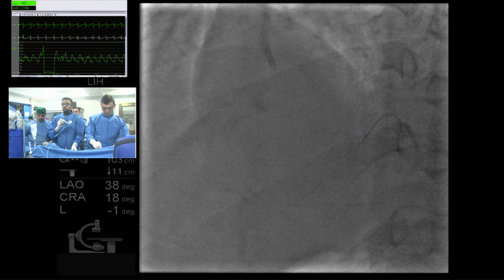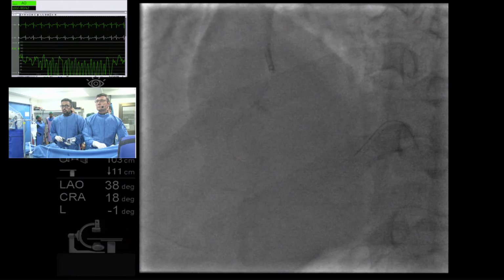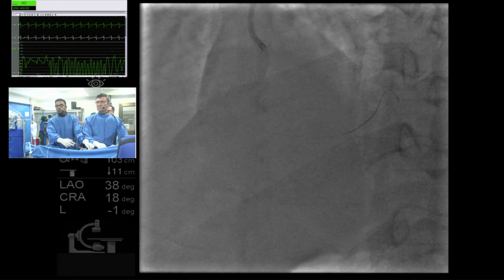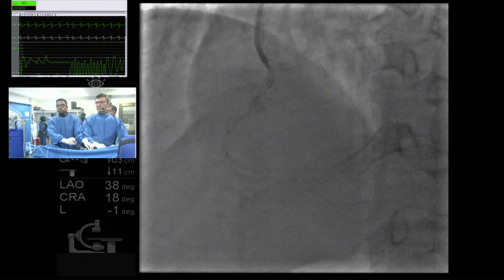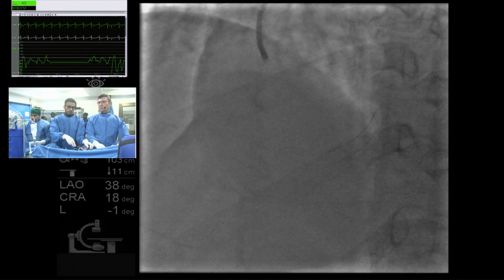Yes. If we use the lumen measurement, we try to select the quarter size bigger, and if we can measure the vessel area at the EEL, we can reduce the quarter size. Yes. And Dr. Akasaka, when the lumen is not circular, do you average the shorter and the longer diameter? Let's go up there.